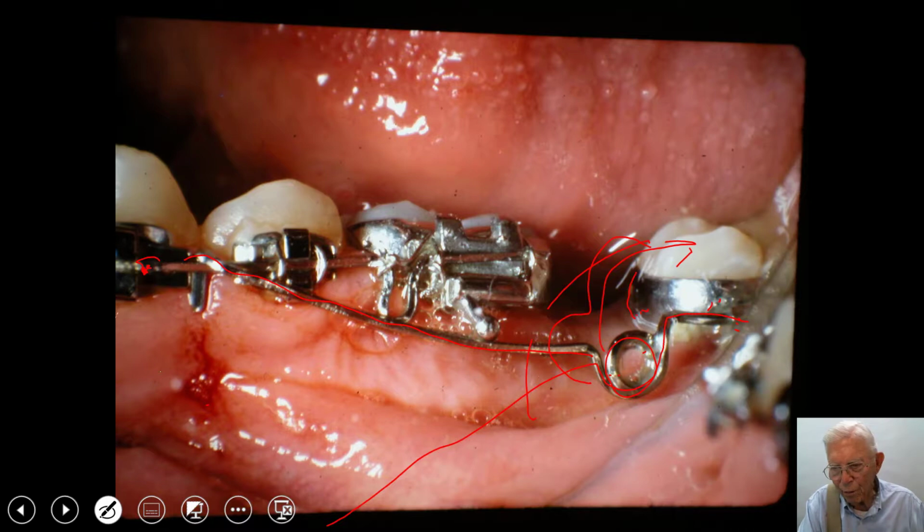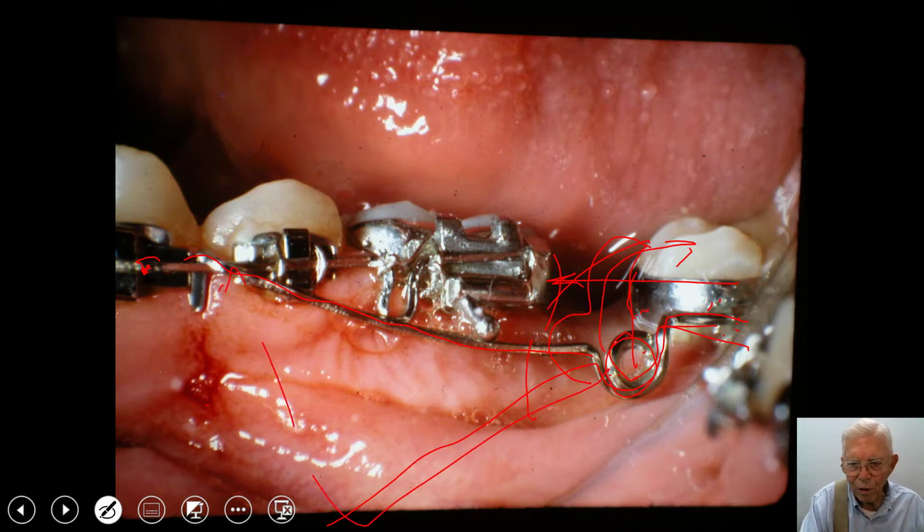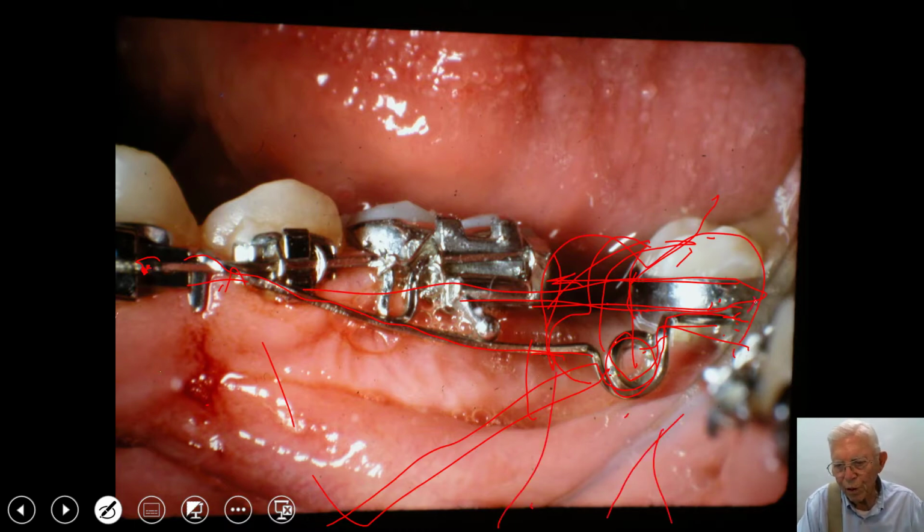Now, when you get it up in this position and you need to bring this tooth forward, you keep this in there with some of this action on it. In other words, this springs here. You take some of it out if it starts to kick back and face. In other words, if the tooth starts leaning back here, you have to take some of this force off. But just keep enough force. And now we can come in with something and tie onto here, or a class 2 elastic. You can slide this tooth forward, and the roots of it will be parallel with the roots of the other teeth up in here. And I'm sure this was a mistake that I made. I'd have to go back and look at that to make sure.